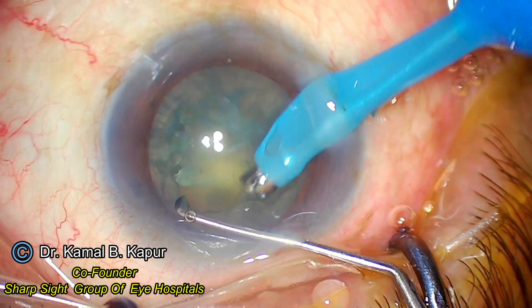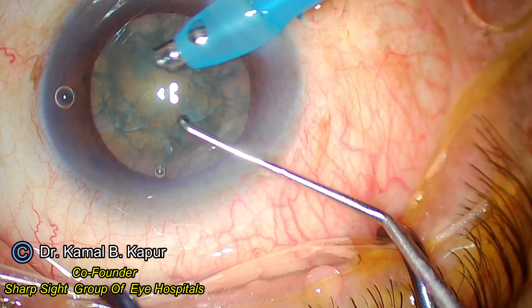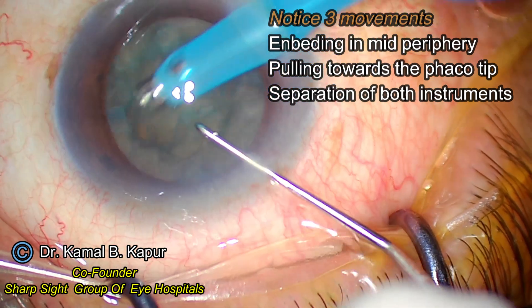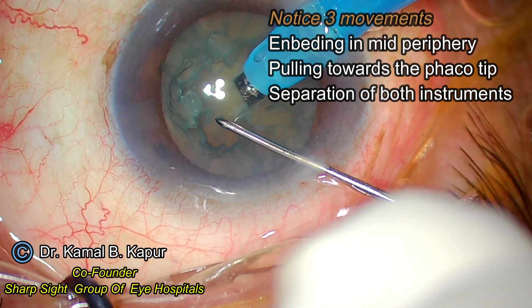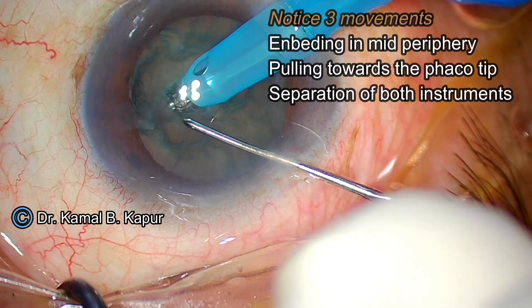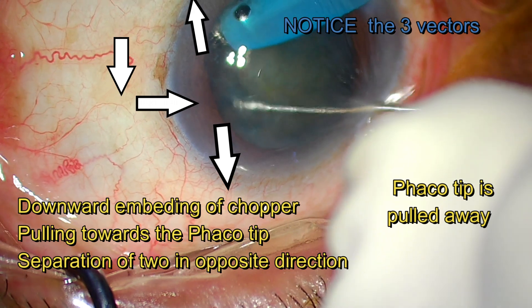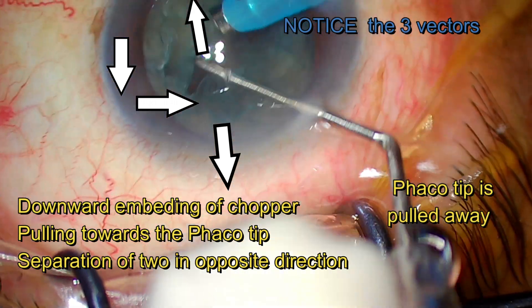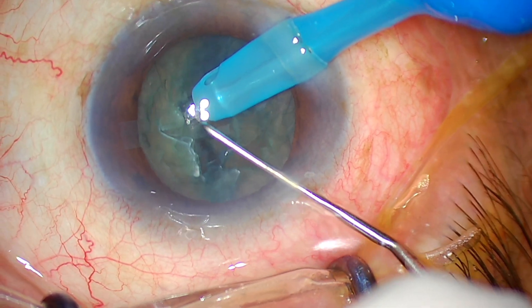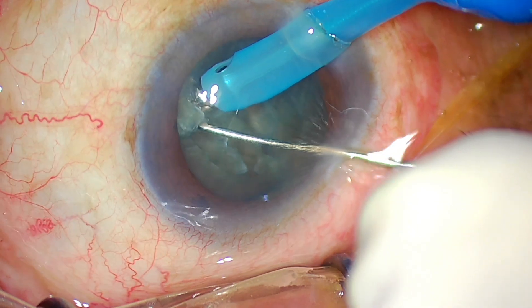A horizontal chop requires coming in horizontally, engaging the nucleus, and separating. A vertical chop comprises two movements — downward engagement and splitting. A peripheral chop comprises three movements: first moving downward, then towards the phaco tip, then separation. We create an engagement of the nucleus at 30-35 degree embedding. Go to the periphery, embed in the center, pull towards the phaco tip, and separate.